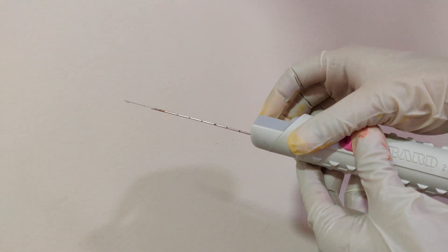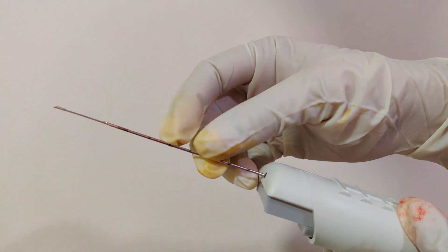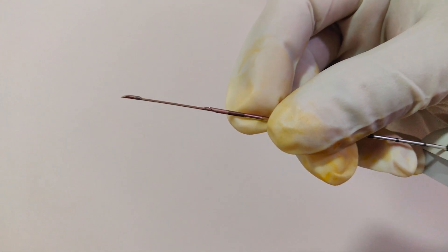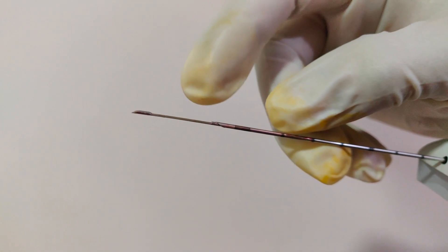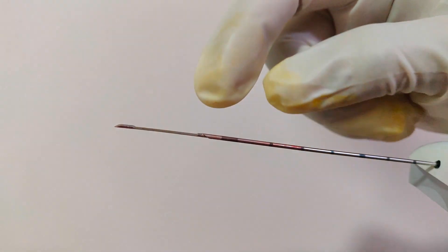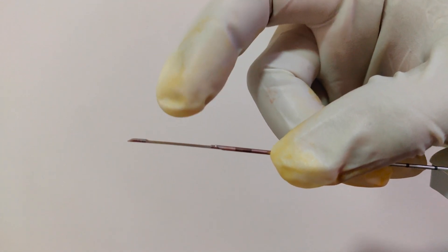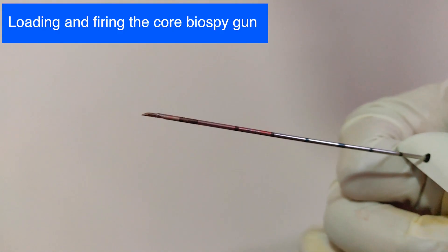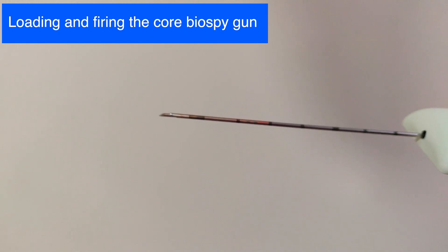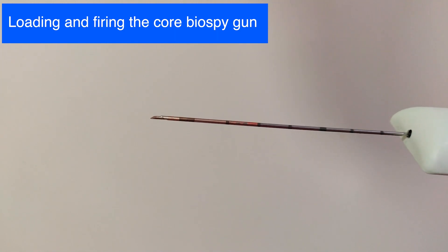Now I am pulling the outer button that charges the outer cannula and exposes the inner stylet. As I said earlier, this stylet contains a sample notch in which the core is collected. Now I will charge the gun completely by pulling the other button as well, and let us see how the core biopsy gun needle travels in slow motion.